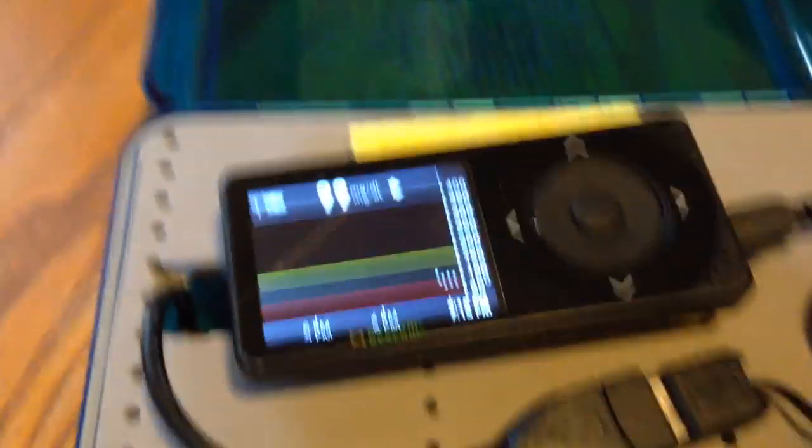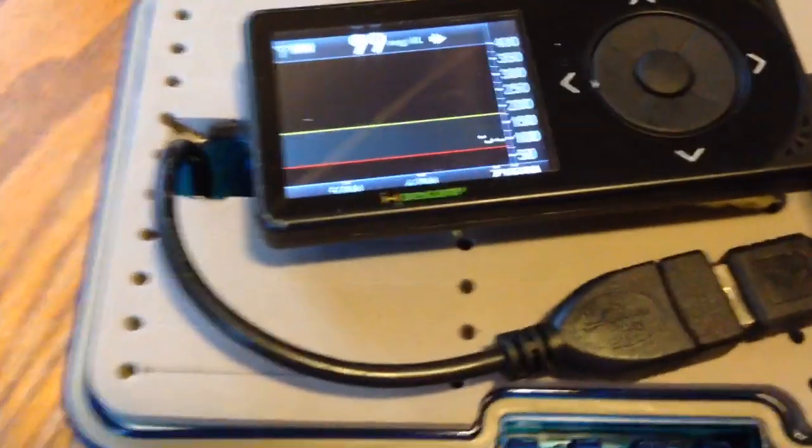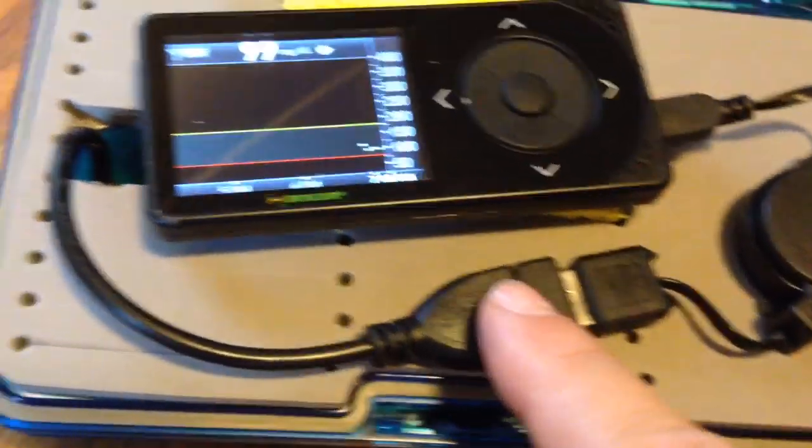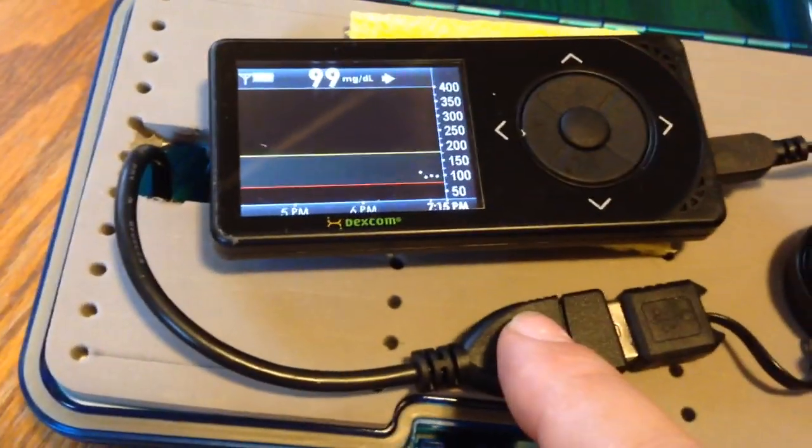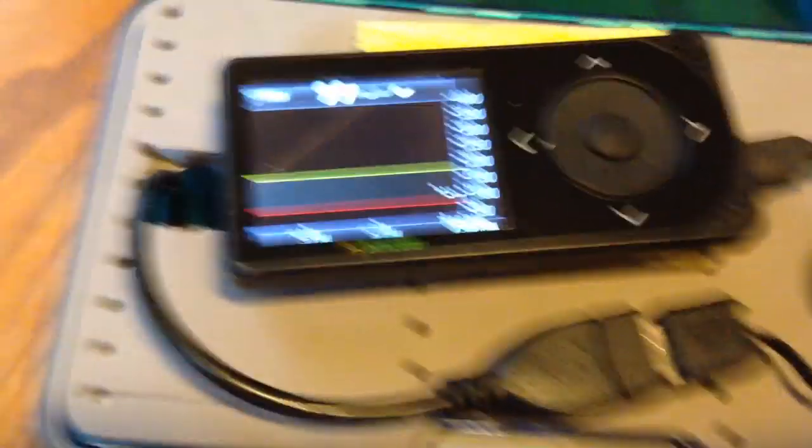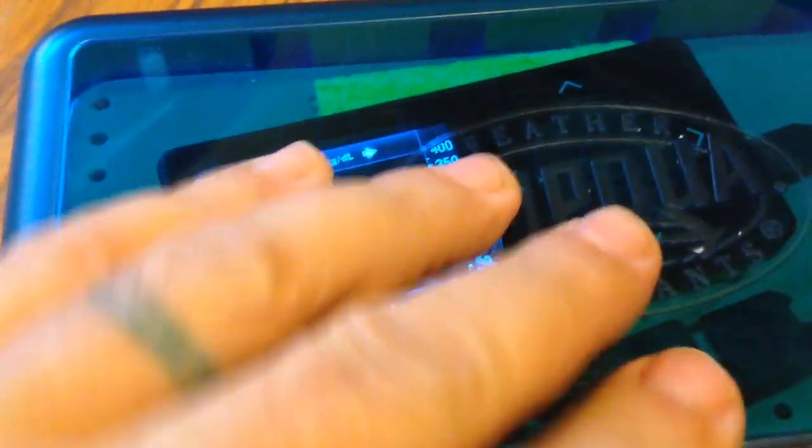This Dexcom receiver is plugged into a mini-USB port. That mini-USB port is connected to an OTG-USB cord, which goes through to the other side of the mini tackle box here, which is plugged into an Android phone.